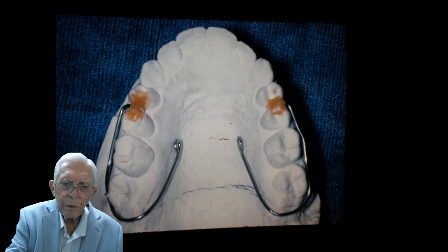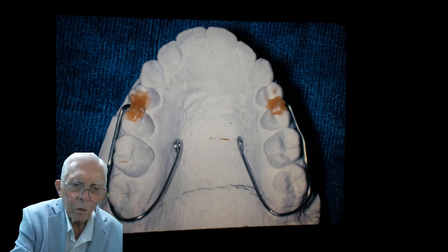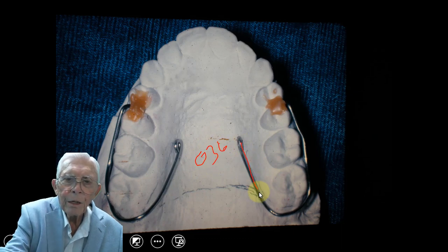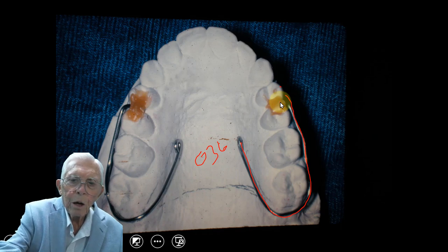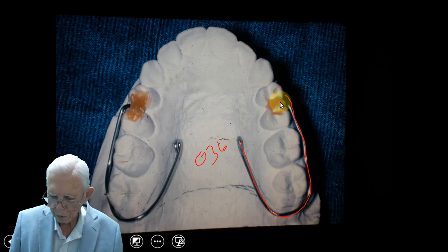When I make a retainer, we put a 036 wire in the back, come around the last tooth, come up on the side, and sticky wax it in here. Then we take a 028 wire and go around the outside. I'll show you pictures of that later.